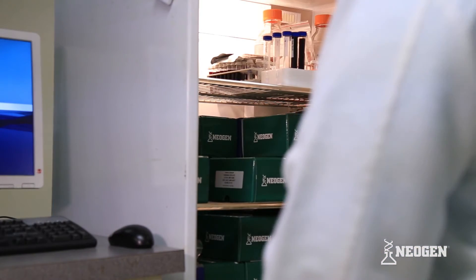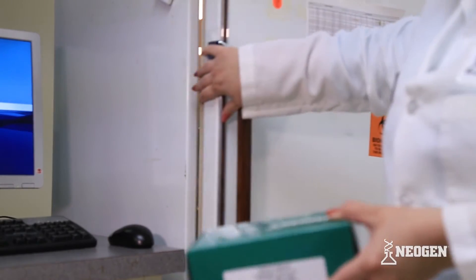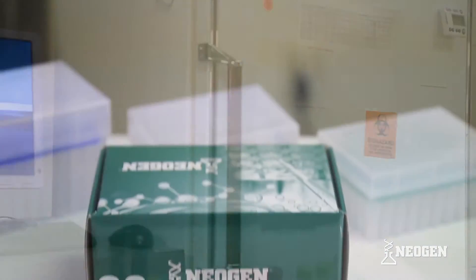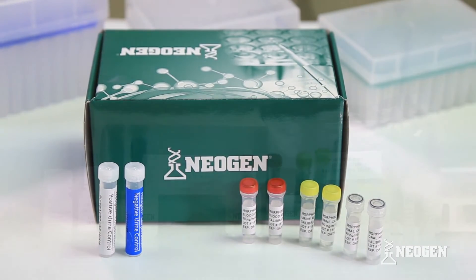Setup. When you are ready to run your samples, remove the Neogen Kit from the refrigerator. If any kit components, like controls, are stored frozen, you will need to take them out at this time so that they can thaw completely before beginning the run.